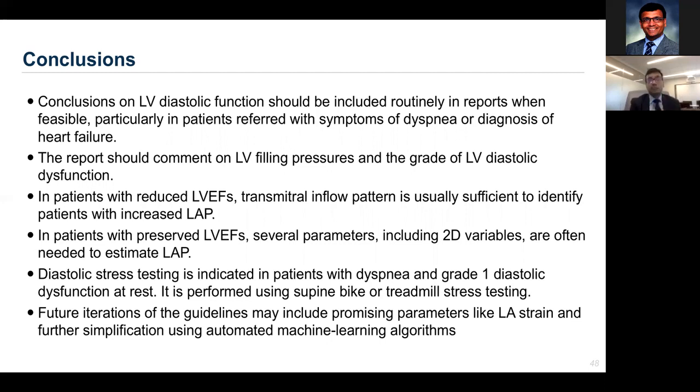Diastolic stress test is emphasized in the guidelines, particularly for patients who continue to have dyspnea of unknown origin and where you do not know whether it's coming from the myocardium. And if you cannot get the answer on exercise echo stress testing, you may also need to look into exercise cardiac catheterization to get the answer.